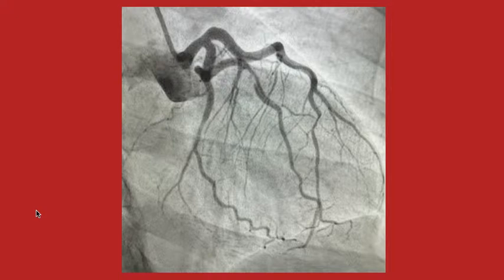This is a good view of the left main LAD, and what I'm pointing out right here is actually a coronary artery dissection of the obtuse marginal. So this patient actually required a surgical consult to have this repaired. So the ECG does not know why it's having an acute infarction. The cells are just going to respond regardless of the underlying mechanism for an acute occlusion of the principal vessel.